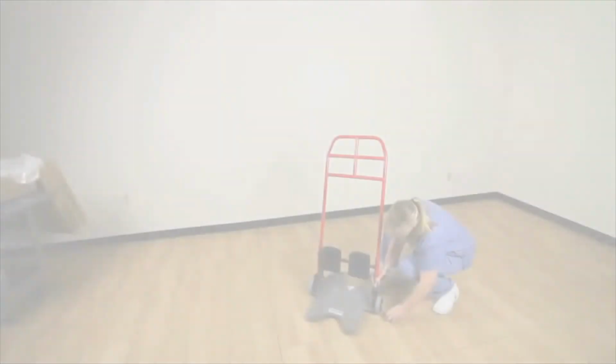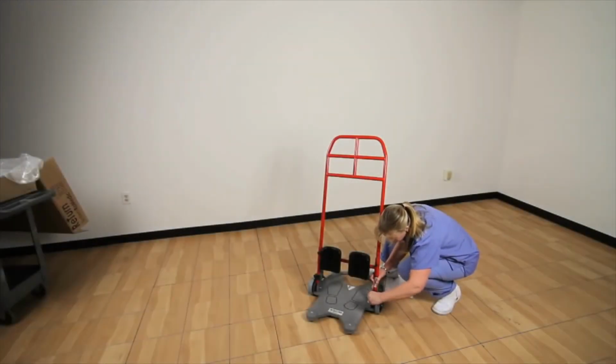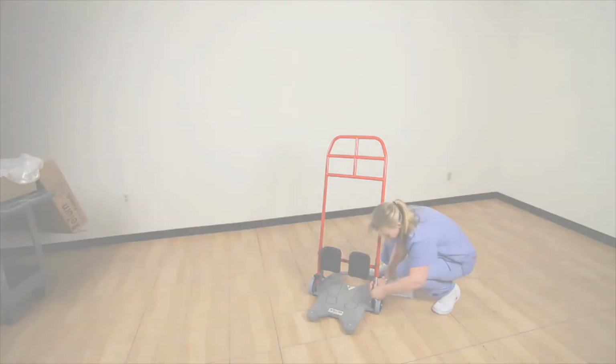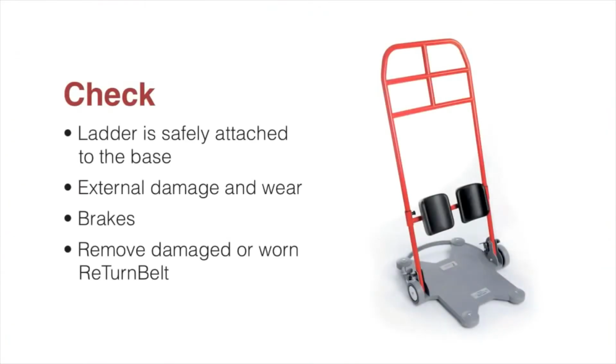For safe and trouble-free use of the Return 7500, there are some routine procedures that should be performed prior to each use. Before use, check that the red ladder is safely attached to the base. Check the 2 bolts. Check that the brakes work. Check that the return belt is not damaged or worn.